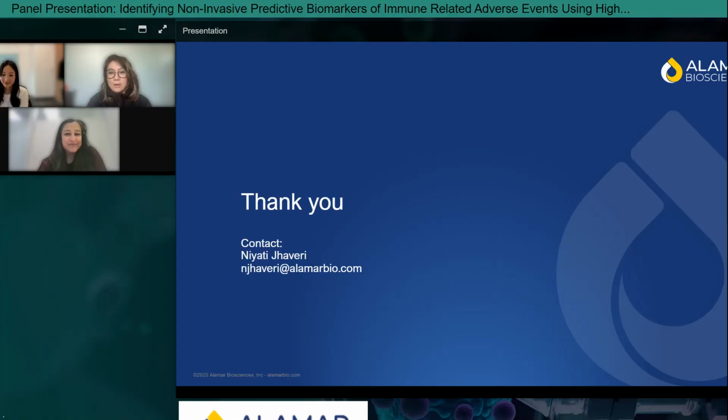The next question asks, what other sample types have you tested on the NULISA system? That's a great question. Given the high sensitivity and the wide dynamic range of NULISA, it's really broadly applicable across many different sample types. And you've heard from Jamie about testing in urine samples. We've also tested the standard matrices, plasma, serum, CSF, but also non-invasive sample types such as saliva, nasal swabs, and sputum.